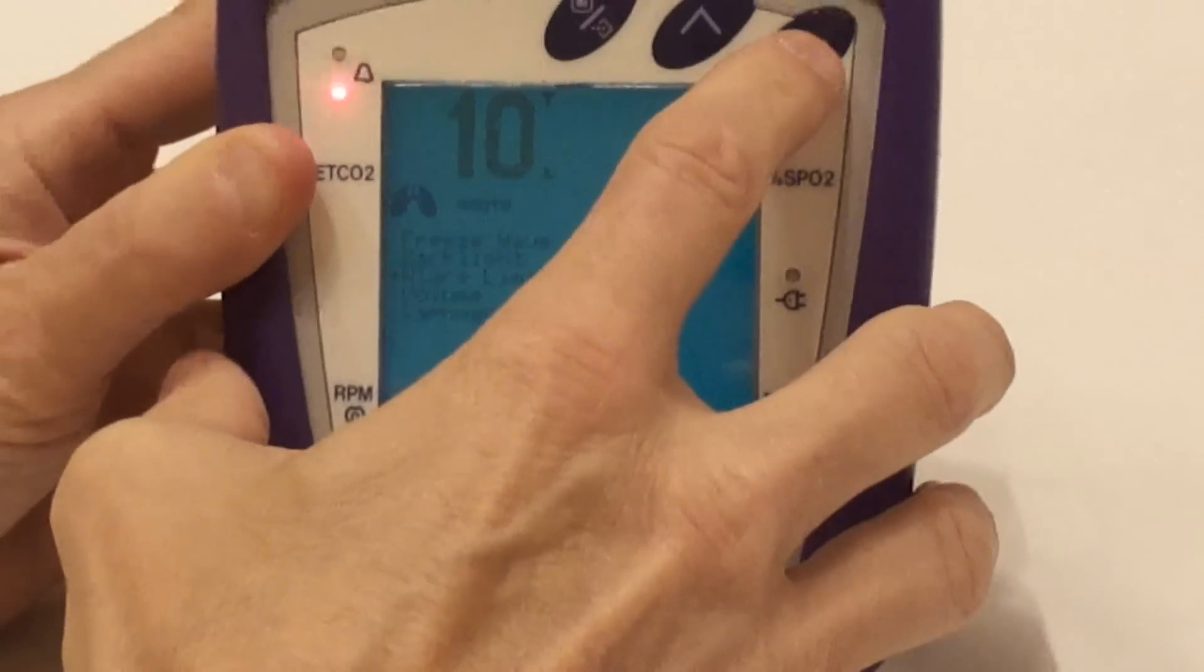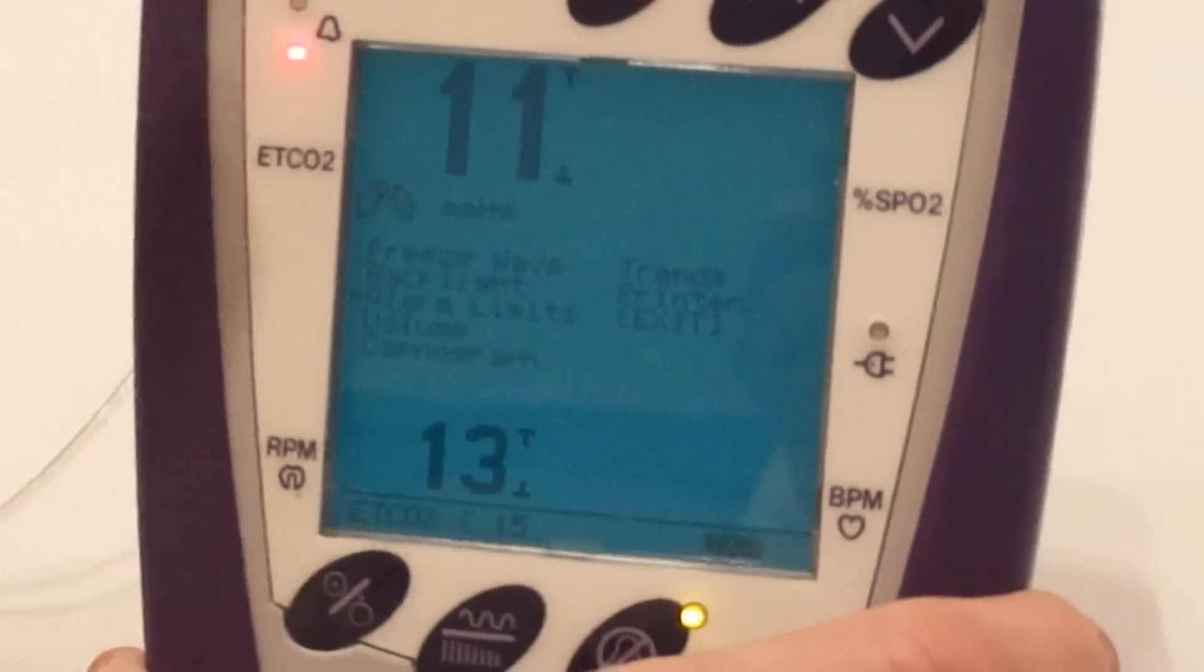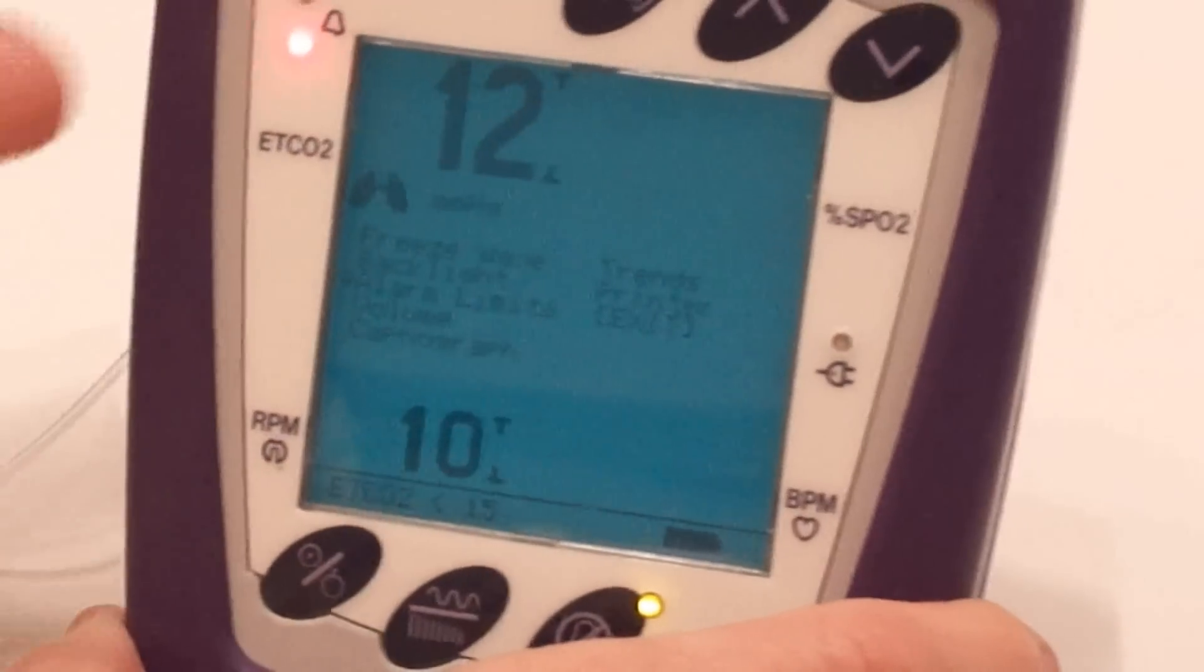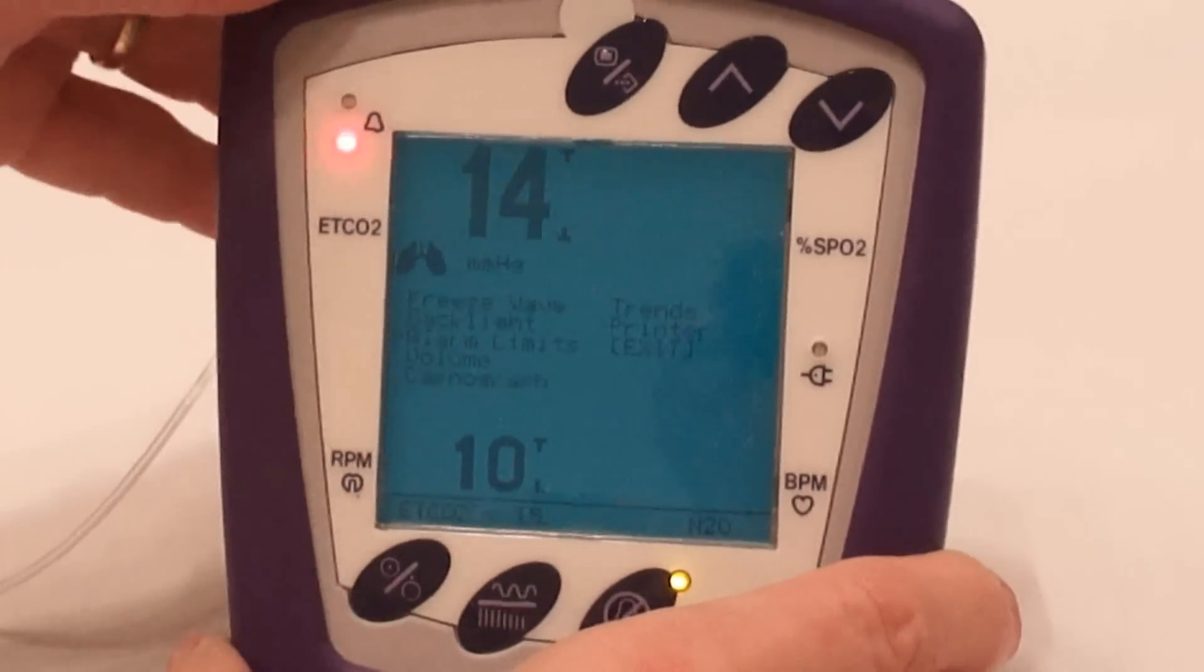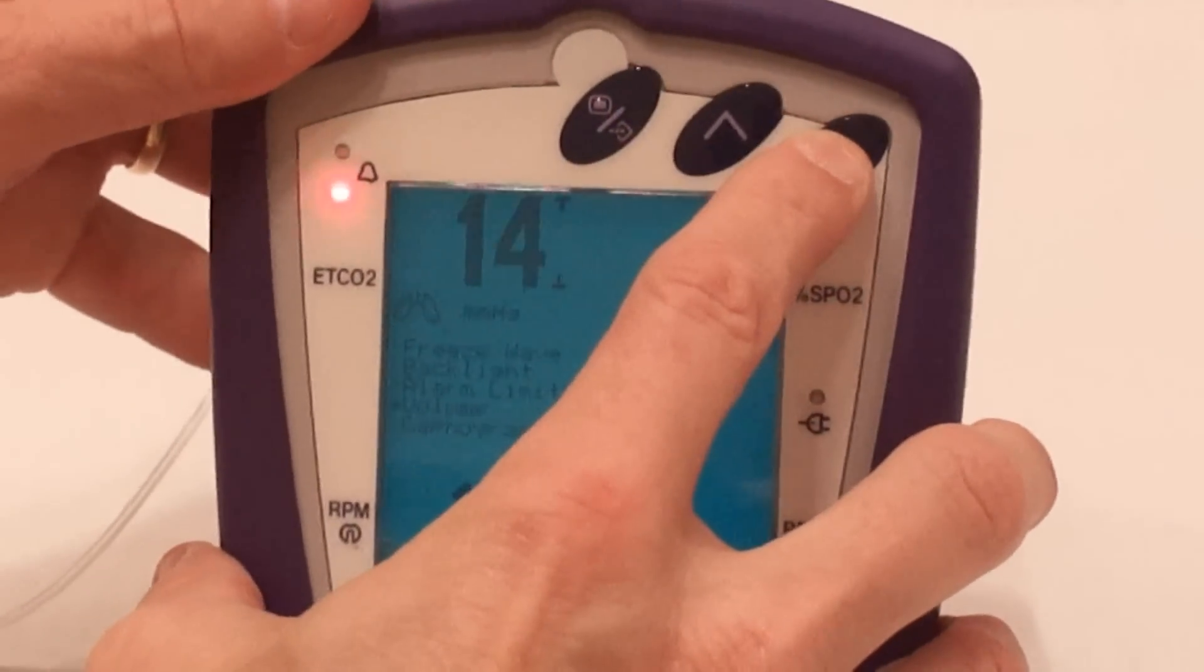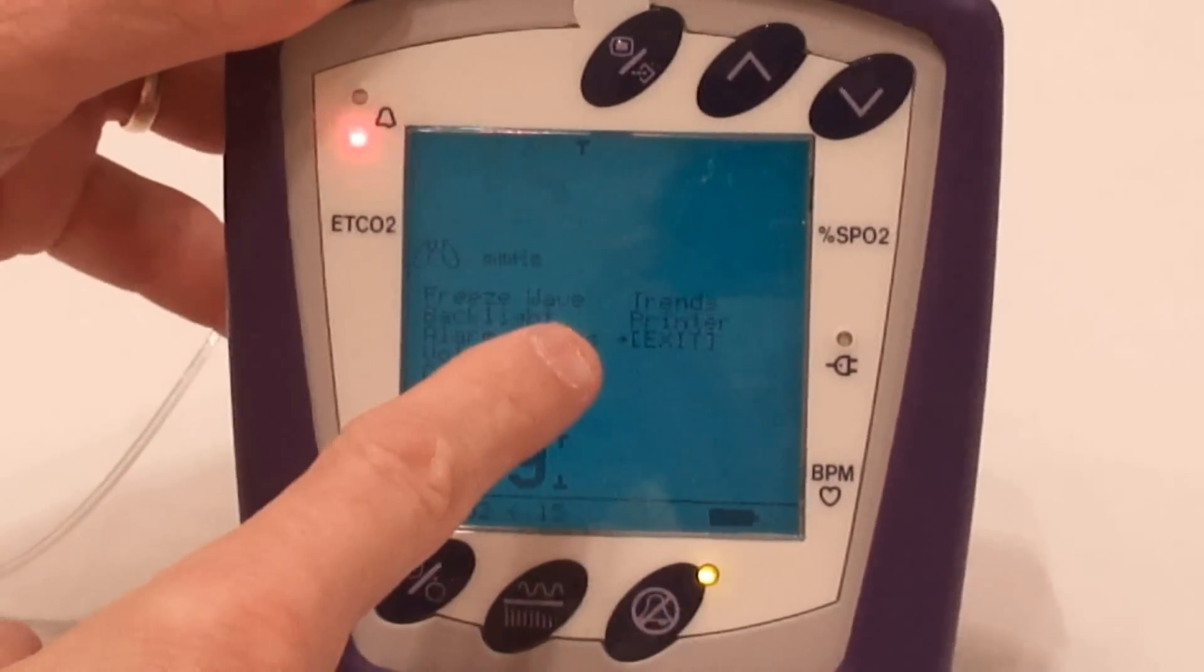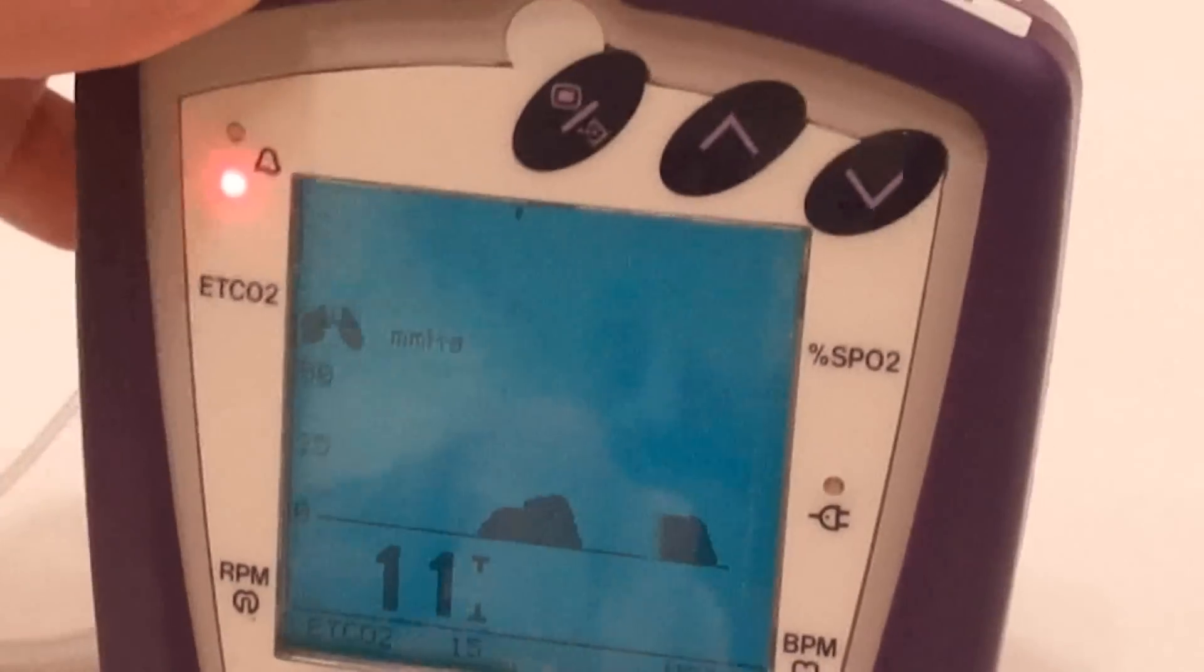Like that. Okay, now to exit the menu, we can also set the volume of the alarms. We can also set capnography to turn it on or off, which you would always leave it on. We can also set trends and printer. But in this case, we're going to go on down to the exit on the menu button. As you see right there, a little arrow is pointing on the exit. Then you press menu button and you're right back where you were.